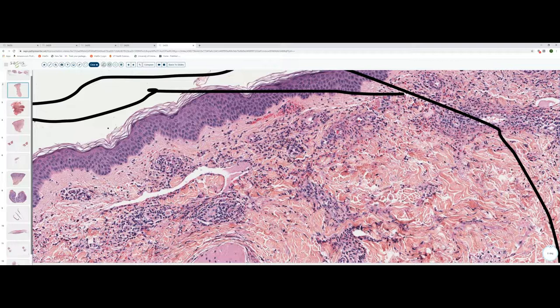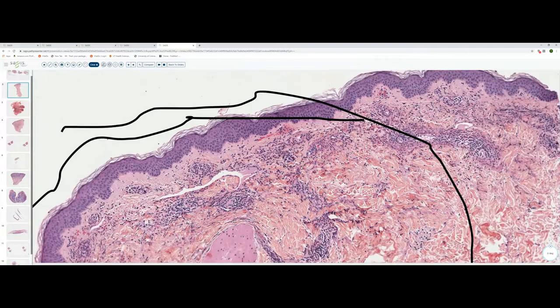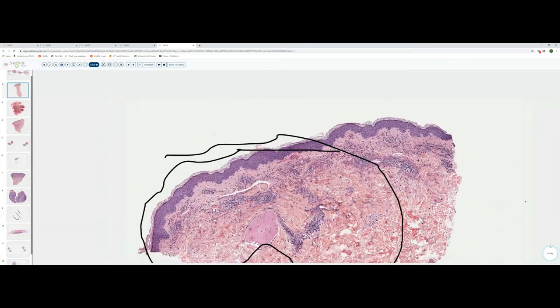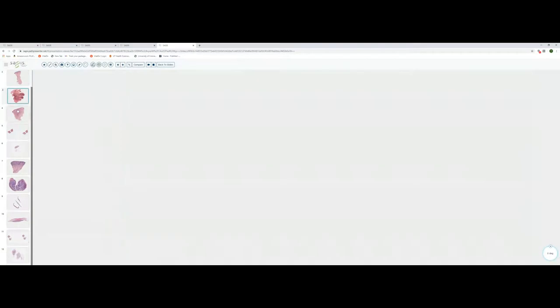Now, sometimes in very early leukocytoclastic vasculitis, you'll see a mixed cell infiltrate dominated by neutrophils and neutrophilic nuclear dust, but you won't always see in very early lesions a lot of fibrin deposition. So these lesions do kind of change over time. The other thing that you'll sometimes see in late lesions of leukocytoclastic vasculitis is more epidermal necrosis, and sometimes eosinophils will enter the infiltrate as well to help in the cleanup process. So this is an example of leukocytoclastic vasculitis.